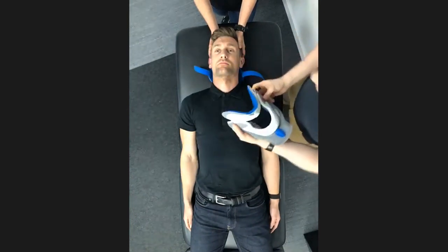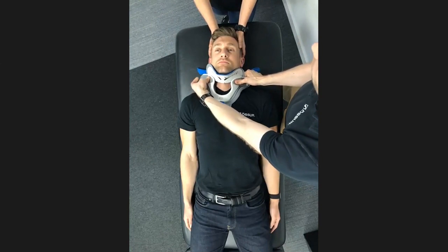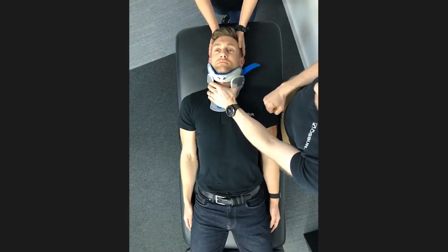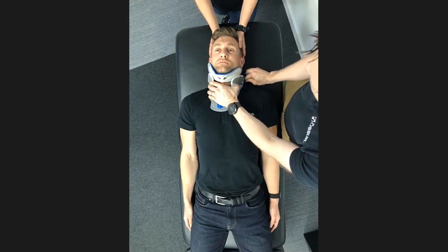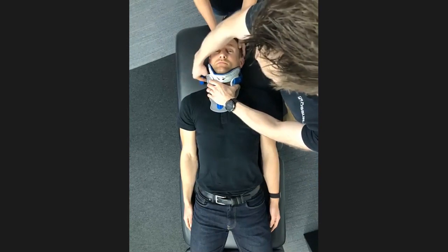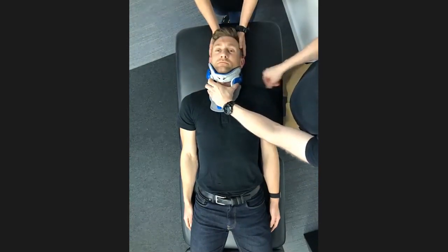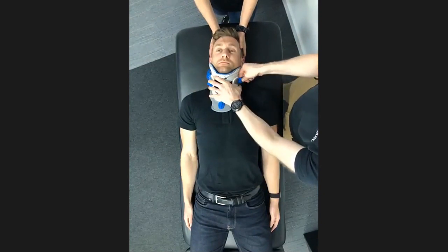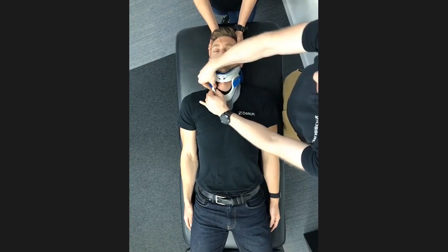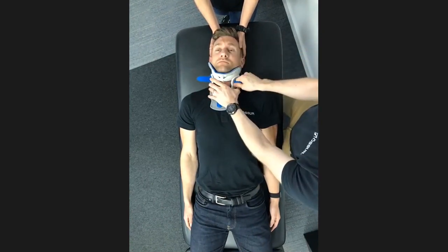Okay, so we're going to fit the collar. What we're going to do is flatten this out, bring it up underneath the chin, and you can see we're making sure we're getting it level with the tip of the chin there. And I'm just going to fasten these straps first of all, just to get it in the right position, and then we're going to make small adjustments as required. So I'm going to open this up on one side and just tighten this up, and we're trying to make sure that we've got this adjusted.